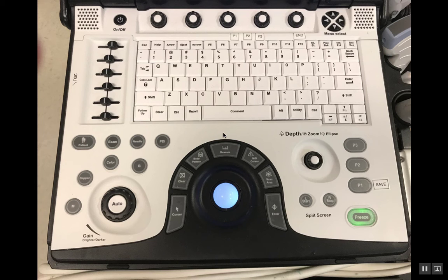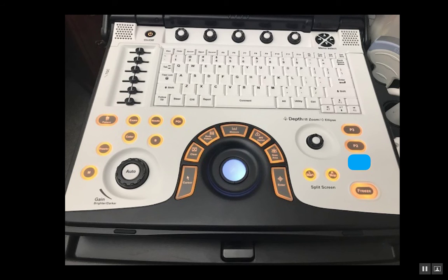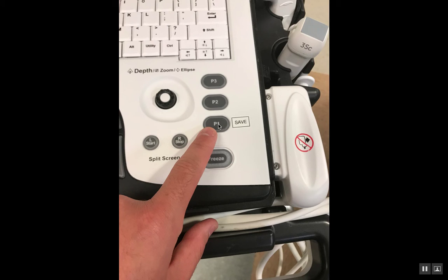They both work. Now, from there, you're going to scan. You have your patient information. It's ready to go. It's on the screen. And now you need to save. The way you save clips is by pressing this button here, P1 or save. This will save 4-second clips. So you press save, and then the machine starts to record for 4 seconds, and you'll hear a click that indicates that you're saving.